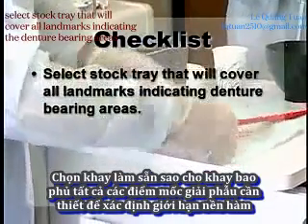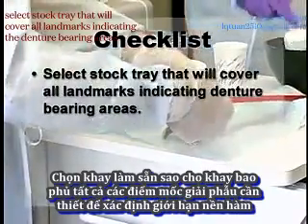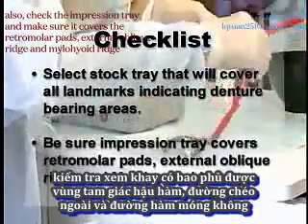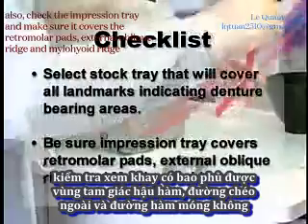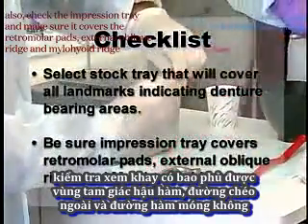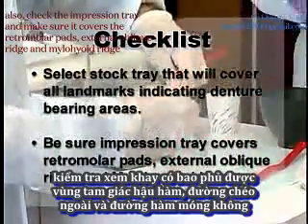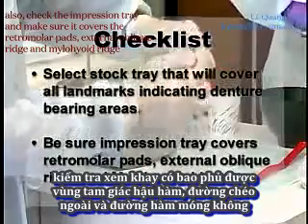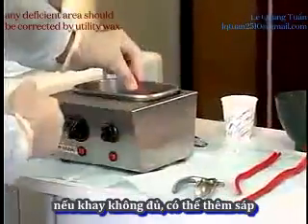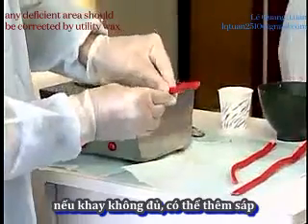Select a stock tray that will cover all landmarks indicating the denture bearing areas. Also check that the impression tray covers the retromolar pad, external oblique ridge, and mylohyoid ridge. Any deficient area should be corrected by utility wax.